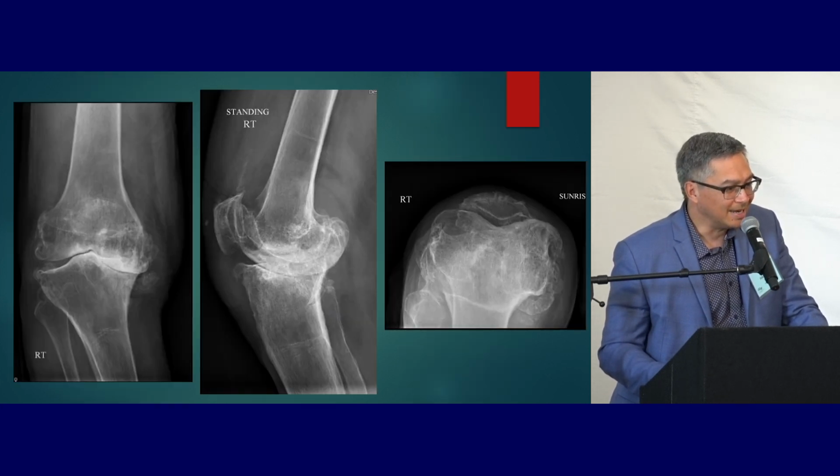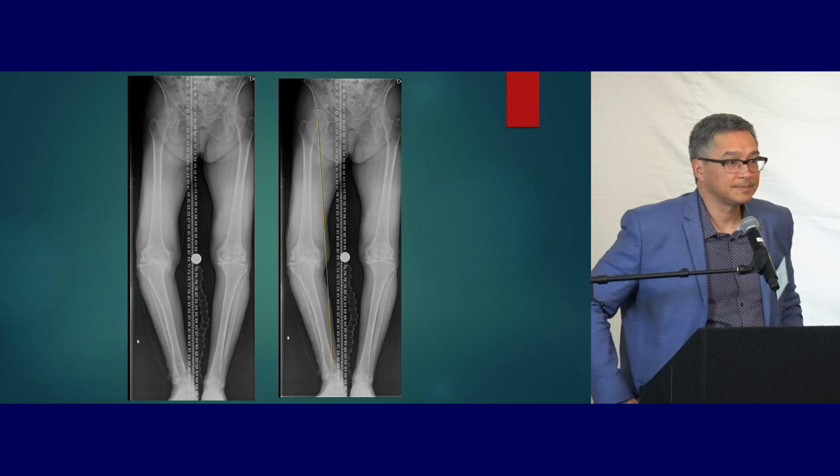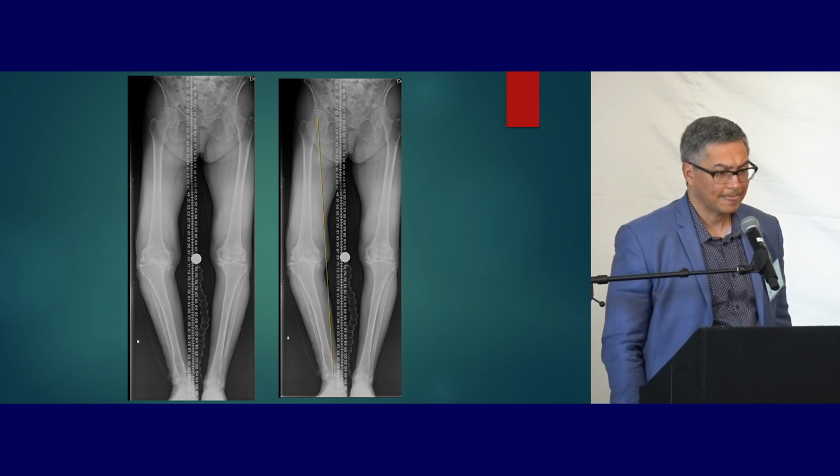But when you see a knee like this, Keith, if you are dabbling in alternative alignment strategies, what's going to be your goal for this patient? Somebody with a difficult knee like this, with pretty significant deformity and bone loss, I'm actually going to revert back to a traditional gap balance PS knee technique. Sometimes it's going to be hard to get that person all the way back to neutral. But in some of the more difficult knees, I do shoot for mechanical alignment and try to get them back to neutral.